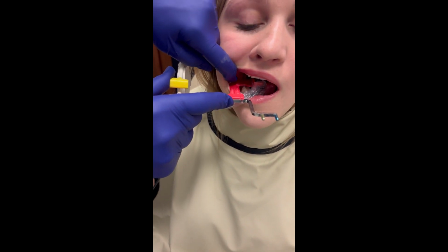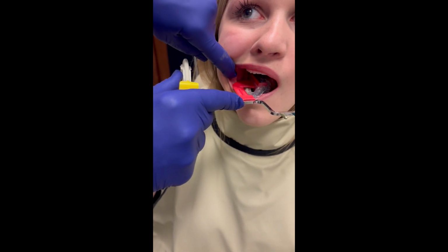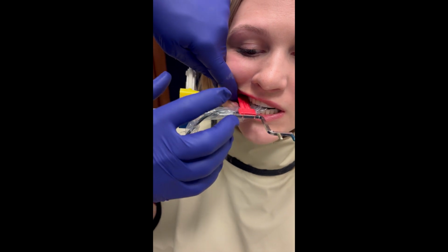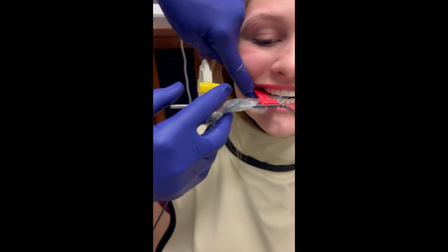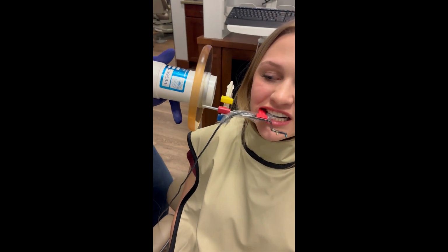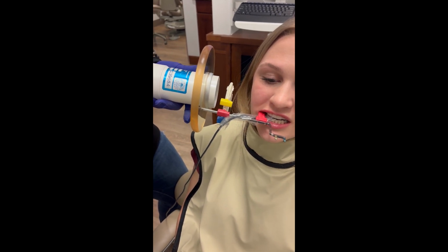So again, I want to make sure that I can see the sensor is at least 2 millimeters behind the last molar in the patient's mouth. And then I'm going to tell the patient to go ahead and bite together. There you go. And I'll have them smile again, showing me their teeth so that I can see where my sensor is. And then we're going to do the paralleling technique again, where the sensor and the teeth are parallel and my central ray is perpendicular to the sensor and the long axis of the teeth.